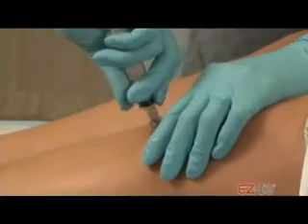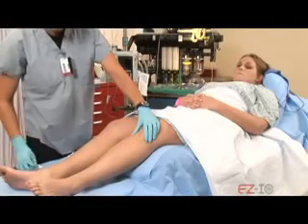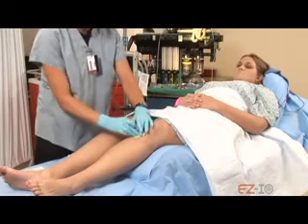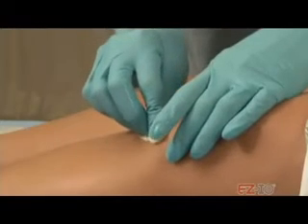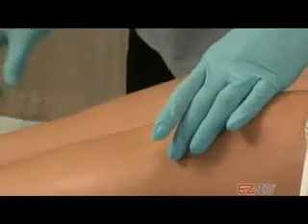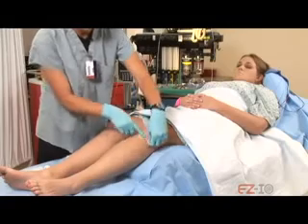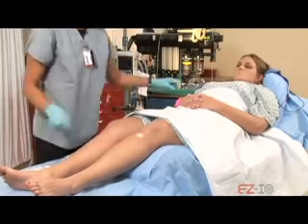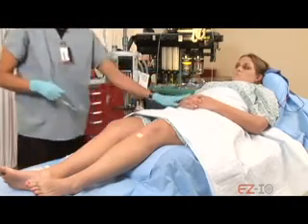Ready? And you're all done. Okay, we'll just get that wristband off you. All right. Good job.